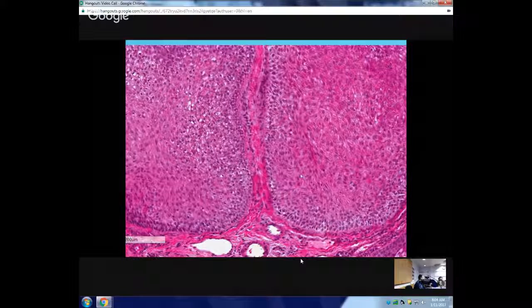In a basal cell carcinoma, within the basaloid cells you're going to see a lot of apoptotic bodies and mitotic figures. Within this basaloid nest, you don't see any apoptotic bodies or mitotic figures. That is another strike against basal cell carcinoma. The stroma is very fibrotic. It is not myxoid. That is another strike against basal cell carcinoma. So you are ruling out the most common diagnosis.